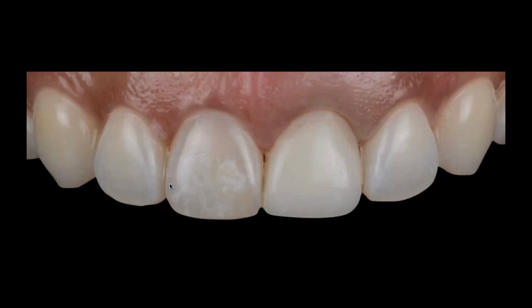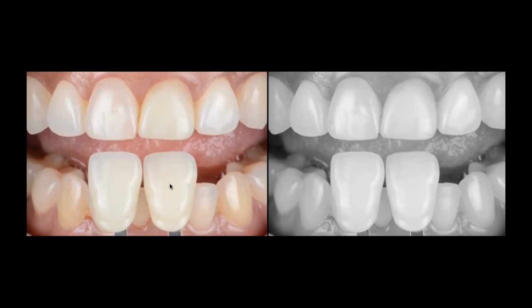So here, I want to take you step by step on how to make the best intraoral impression. This is a provisional number 9, okay? Immediately after removing the provisional, I will go ahead and scan the soft tissue. I have to be ready because once I remove that provisional, the soft tissue will collapse and I will lose that, okay?